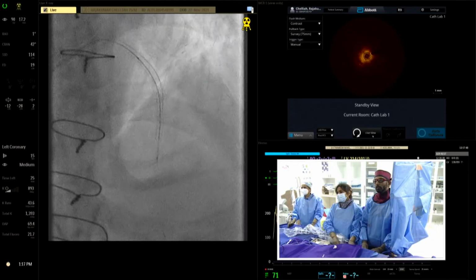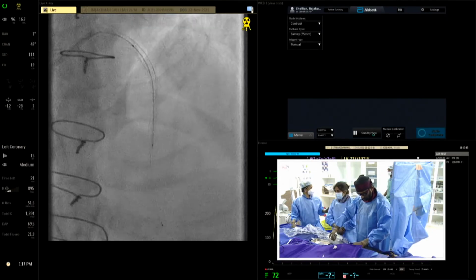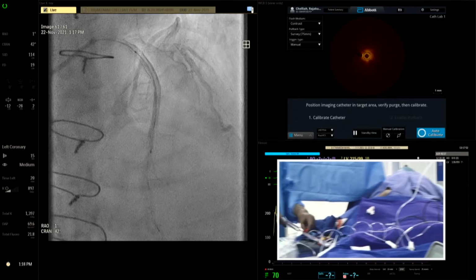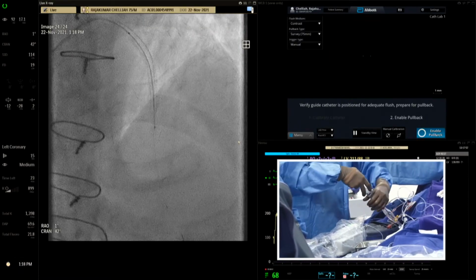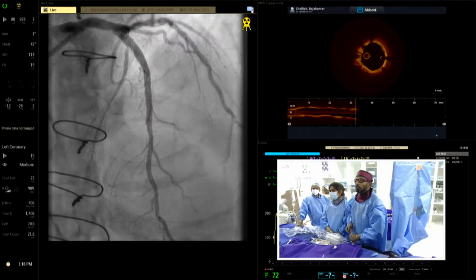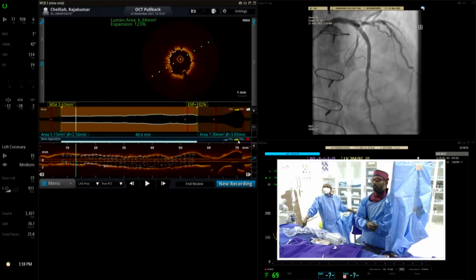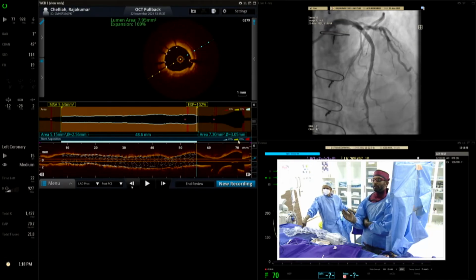Okay, ready? Here. Okay, 20 minutes. No, we are okay, I think. 354. Yeah, that clearance is better. One second. Okay, when you're ready, you tell me. Yes, sir. We are done. Constant pressure. Go in slowly. Excellent. That's good.